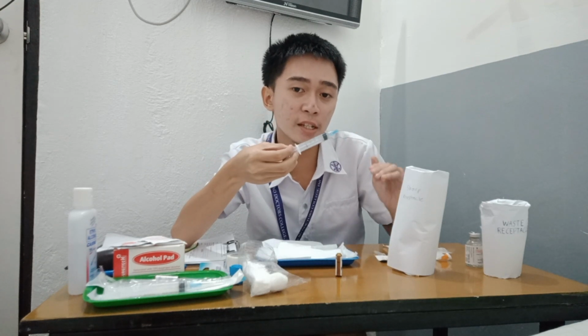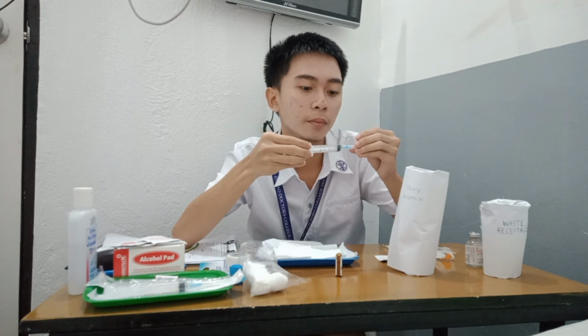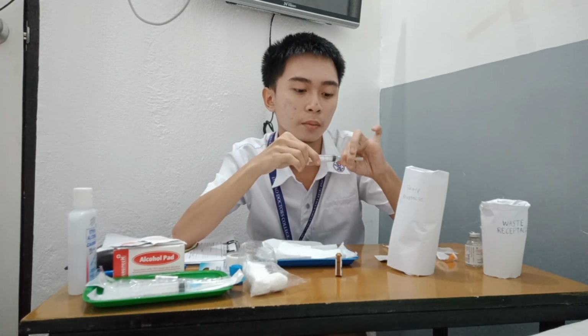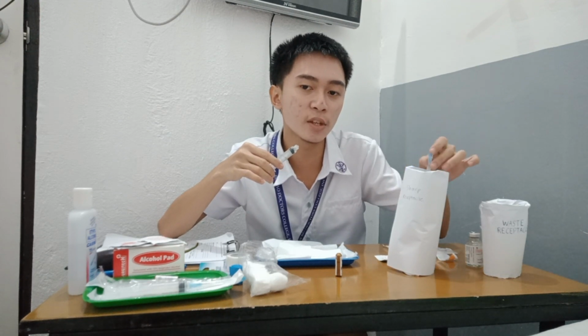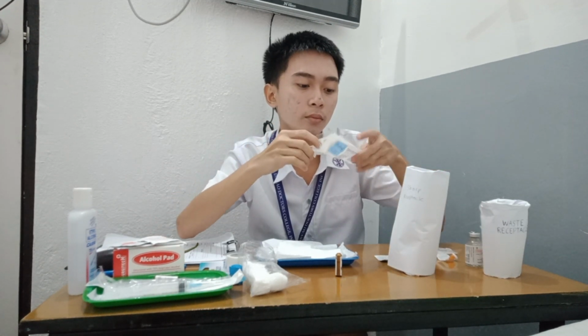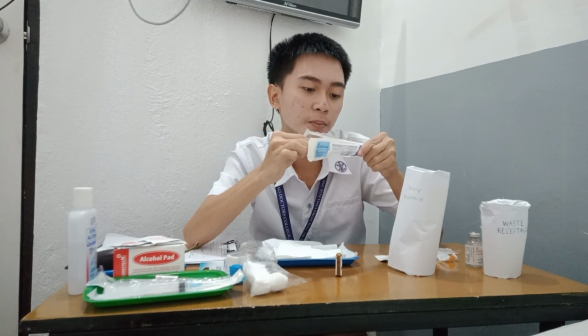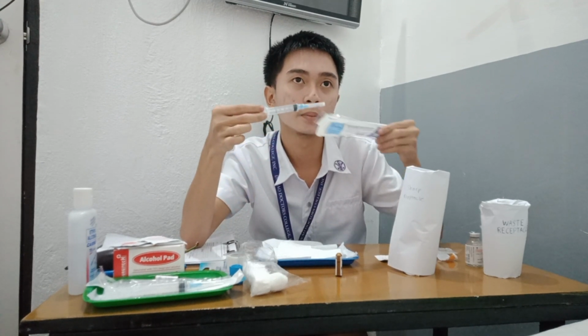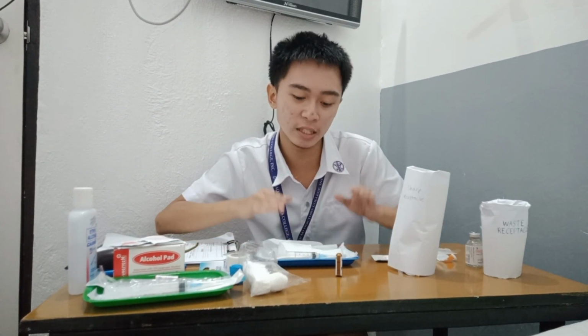So now I'm going to recap the needle so I can take the aspirating needle off, and discard the aspirating needle into the sharps container so that we can avoid needle prick injury. Then connect the syringe to its right size needle. Tighten the cap and the hub of the needle, and place it over to the medication tray. Then I'm going to write the medication ticket.